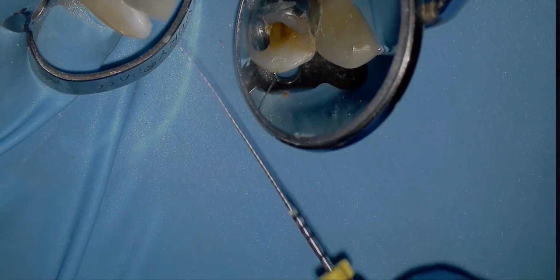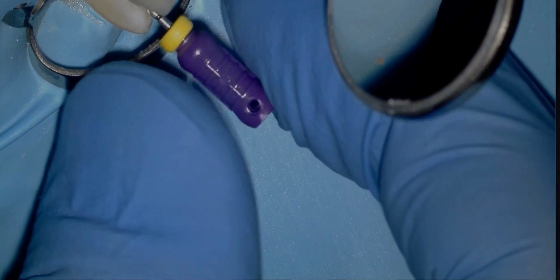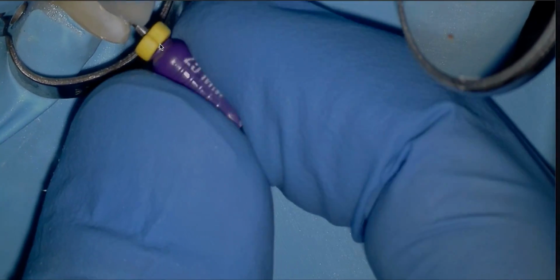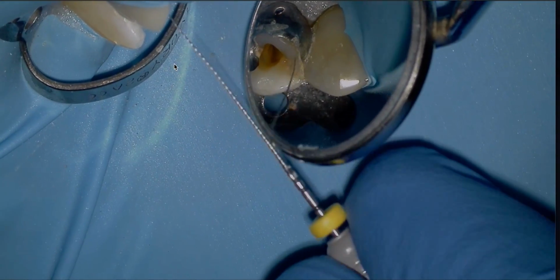In this case, what I'm going to do is ensure that we have patency, and I'm going past. It's not ideal according to the great evidence that Dr. Ricucci talks about. So here what I did was I skipped the 8 file, and you can see from a 6 to, and I'm going to go back to the 8 because it just doesn't work. It's not as effective as going the right progression. So 6, 8, 10.